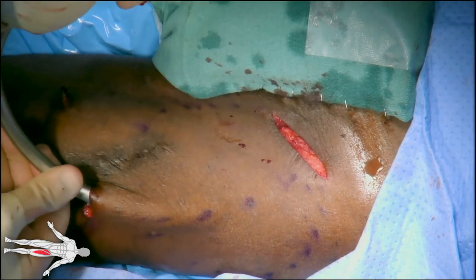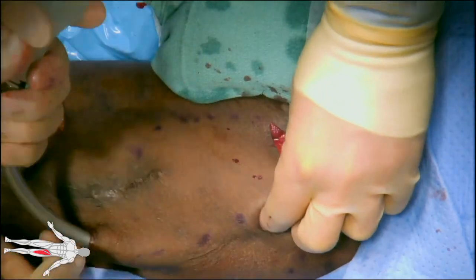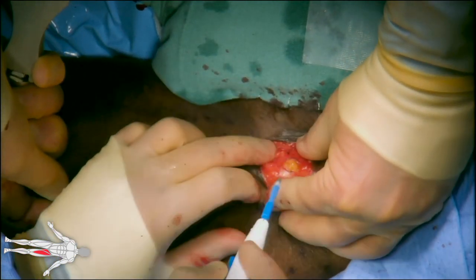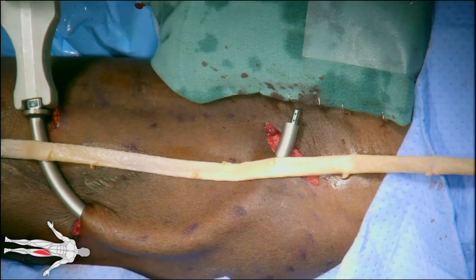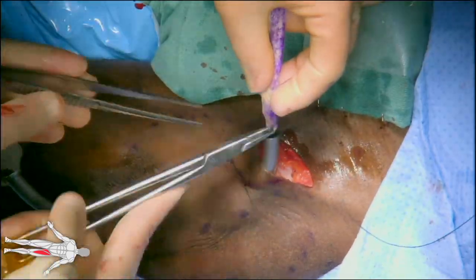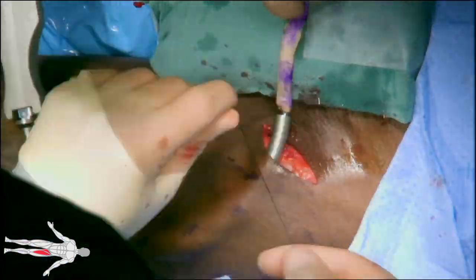Next a tunneler is introduced. Care is taken to make sure that the tunnel is not so superficial as to compromise the blood flow to the skin, and not so deep as to make it inaccessible for dialysis. As we get close to the incision, the tunnel is deepened down through the wound. The arterial graft is then marked for proper orientation for the purpose of tunneling.